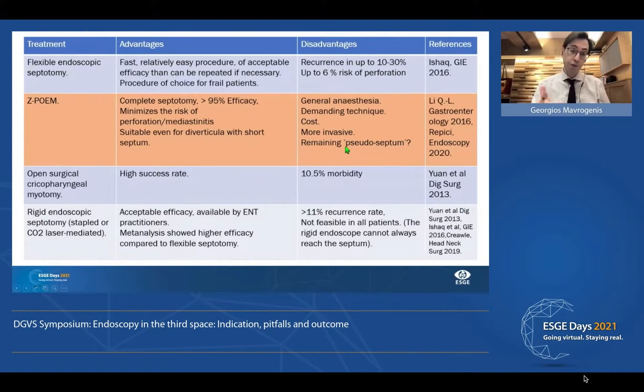After the procedure, there is a septum that remains which does not contain muscle but just mucosa. This will usually disappear, but in some patients it will persist — particularly in patients with large diverticula. In these cases, we just need to bring the patient back after a few months and cut this mucosa with our knife.